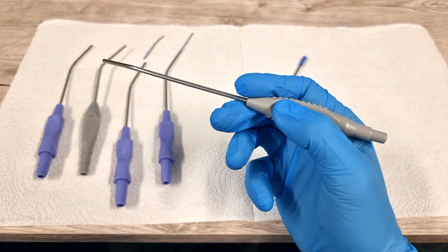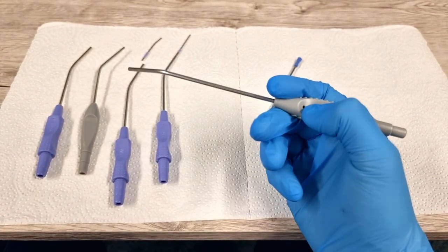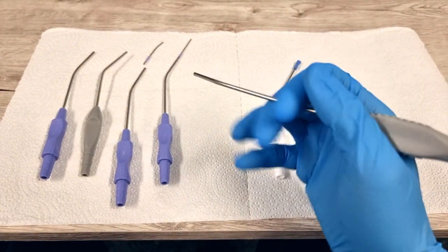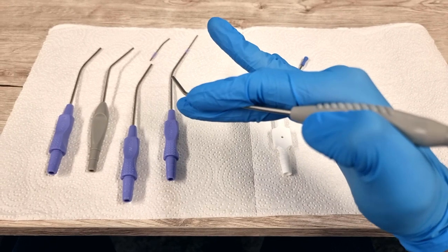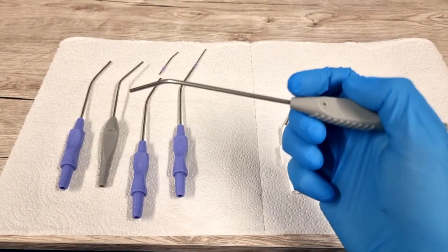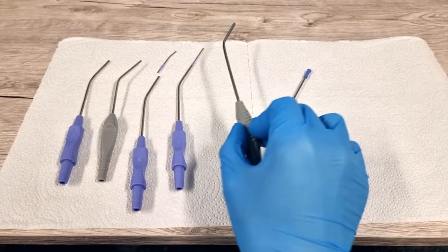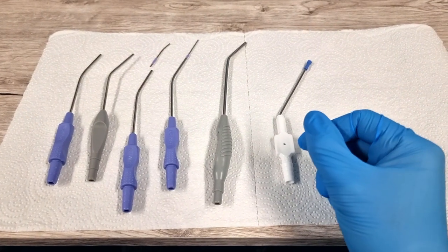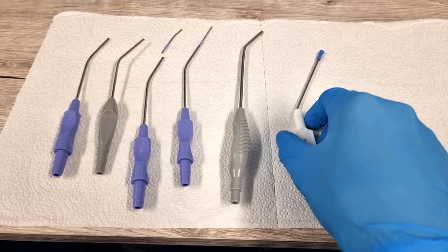As I said, it's not practical to use this all the time because it's so large and beefy, and it's also quite long where the bend is. So it's very difficult to hold it and brace properly whilst covering the hole at the same time. It's very awkward. I don't see many people using the McGill, but it's just something I have around. I've used it maybe one or two times in the past 6 months. It's not hugely used in my clinic.